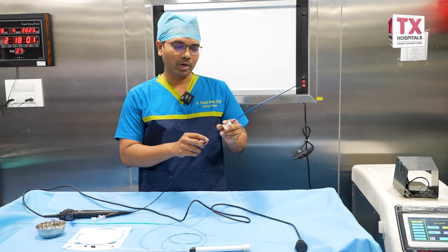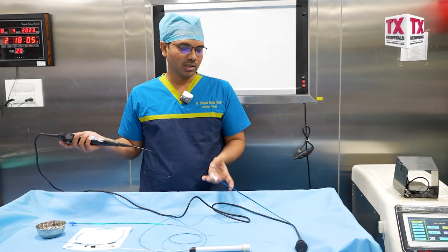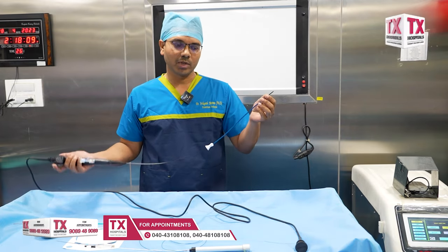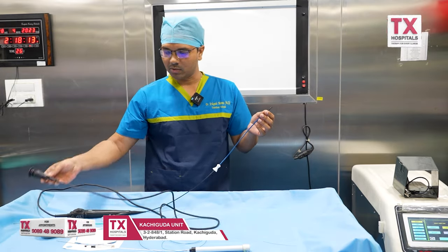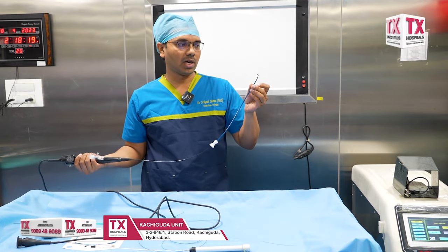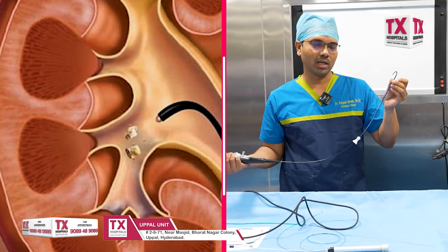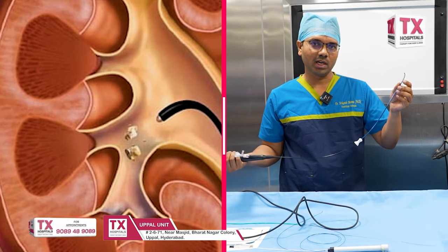With the access sheath, we use the flexible ureteroscope. We connect the other end of this scope with a camera to the console. On the TV there is a video description. We navigate the kidney under vision — upper calyx, middle calyx, lower calyx, lowermost calyx — rotating to identify the stone.